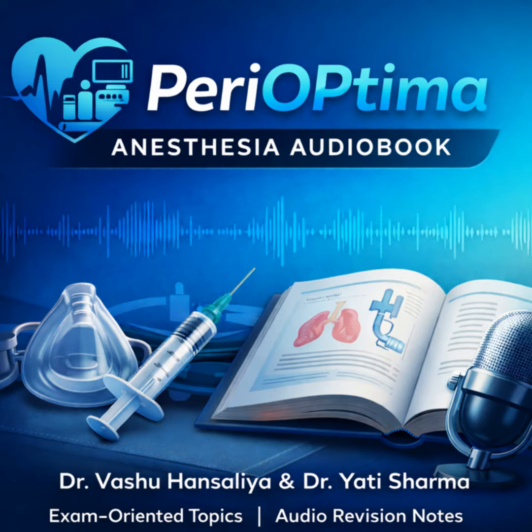The oral approach, oral FOI, seems a bit more complex then. It needs special adjuncts. It's significantly more challenging. The scope can get caught up on the tongue or cheek, and it's much harder to stay midline. This is why you need auxiliary devices. And for the exam, you need to name them. You must. The Ovassapian fiber optic intubating airway is the classic one, the Williams airway, the Berman airway. They all serve a triple function: keep the mouth open, act as a bite block to protect the scope, and guide the scope midline past the tongue.